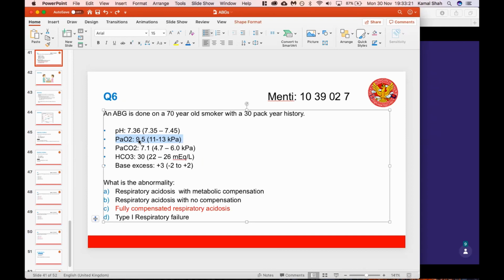So when you look at the oxygen, make sure you always look at whether the patient is on external oxygen or room air as well. But that's a good question, because we really should be looking at the oxygen in all of these patients too.